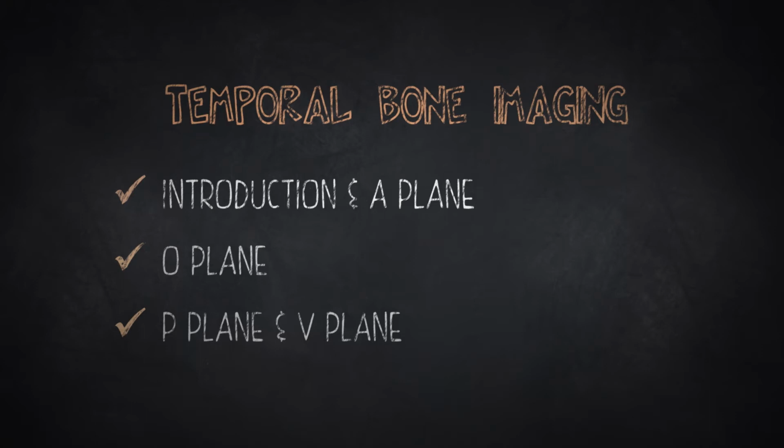We needed to look at the temporal bone with plain X-rays, and also tomograms. Pluridirectional tomograms were used to blur out things in front and behind the plane in the image that you wanted to see. And therefore, the anatomic structures in the plane that you wanted to look at were sharper and not overlapped. And we'll talk about an old article that described using different planes in the coronal plane to approach the anatomy.